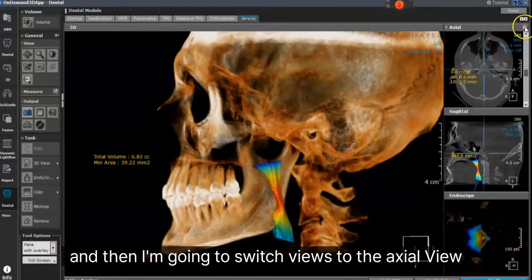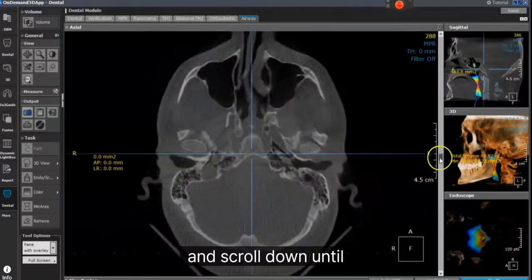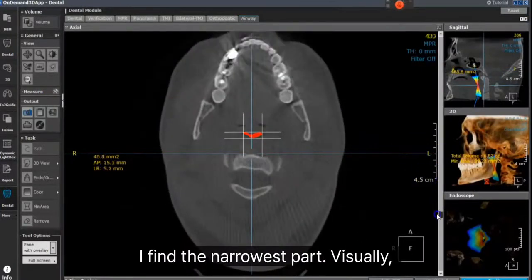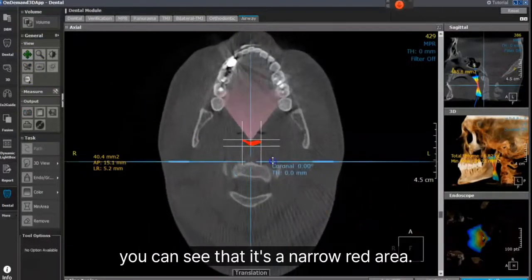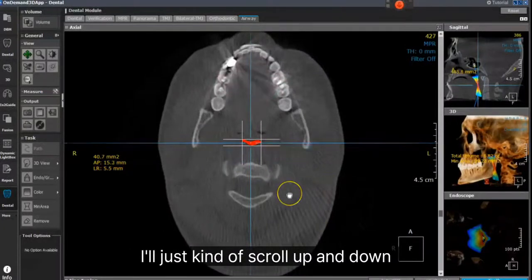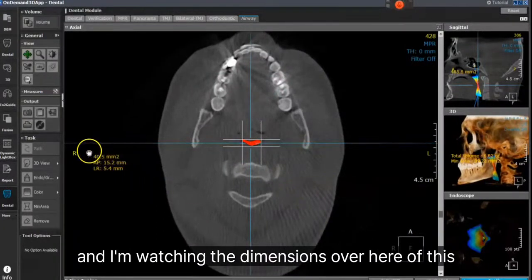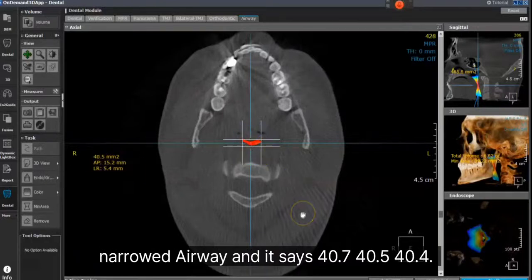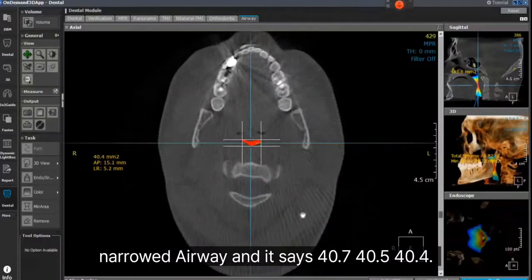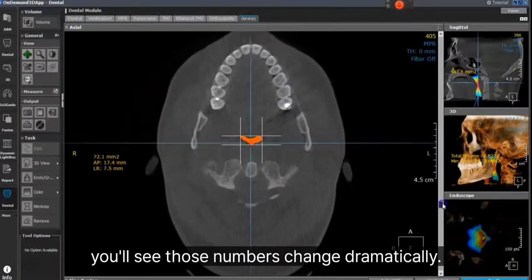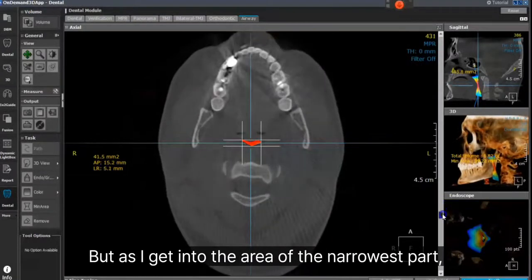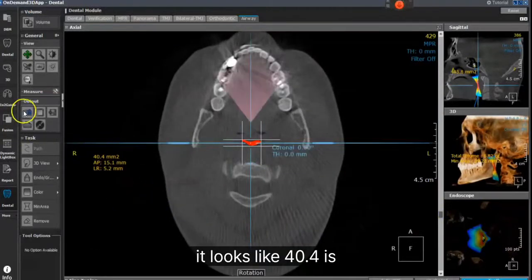Then I'm going to switch views to the axial view and scroll down until I find the narrowest part. Visually, you can see it's a narrow red area. I'll scroll up and down, watching the dimensions of this narrowed airway. It says 40.7, 40.5, 40.4. As I get into the area of the narrowest part, it looks like 40.4 is the narrowest.